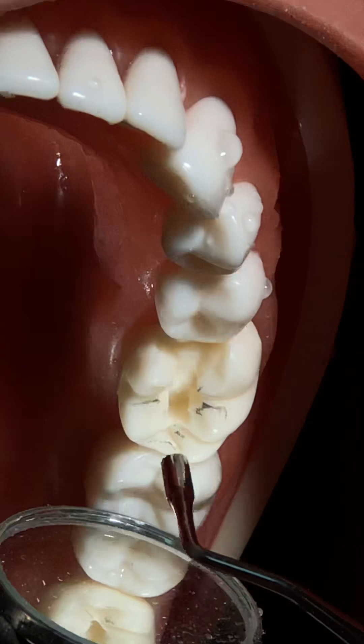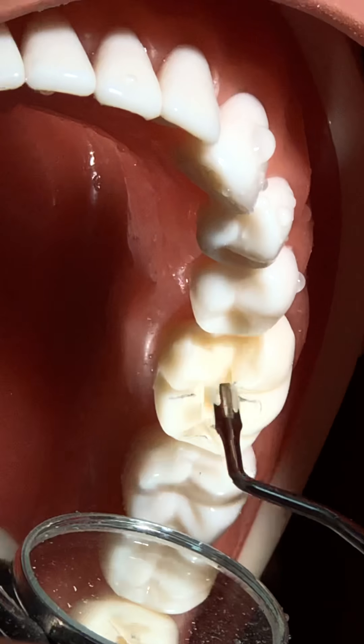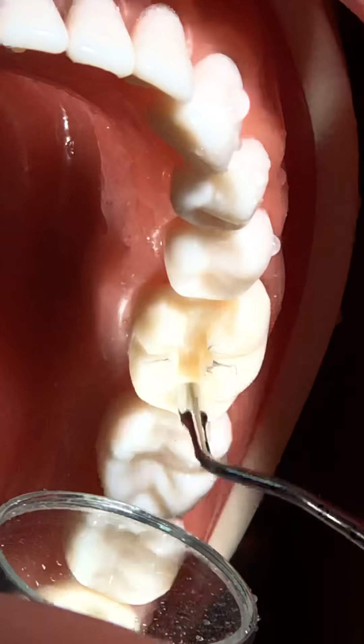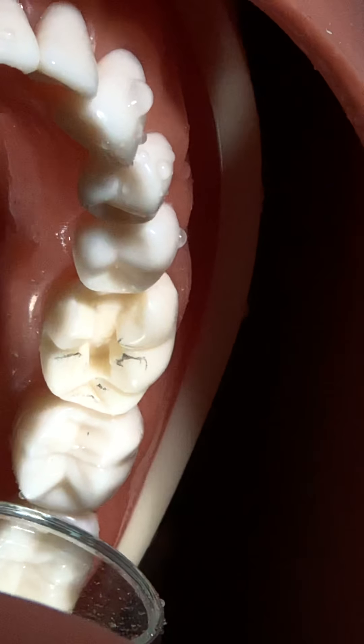This is how you prepare a cavity. If you feel there are some rough margins here and there, you can finish them off with the handpiece, or ideally with a chisel.